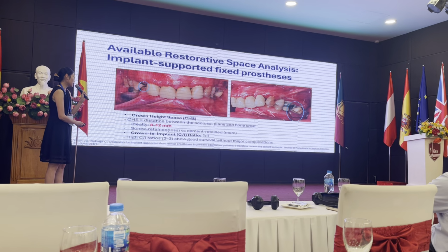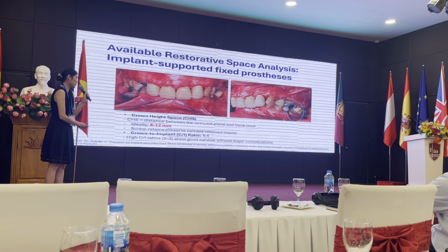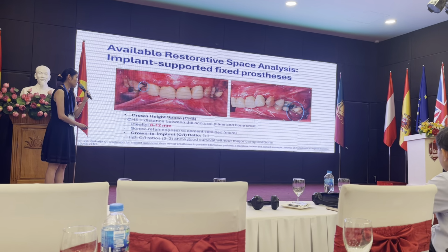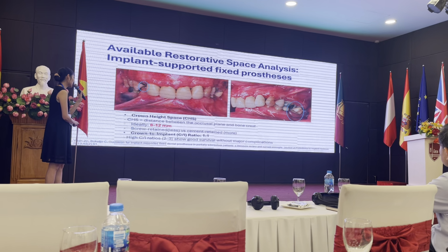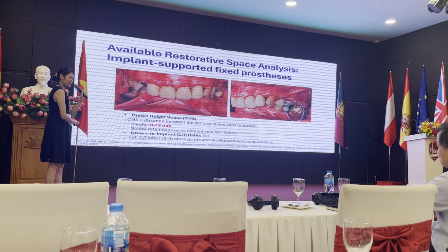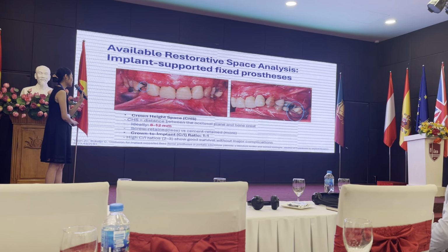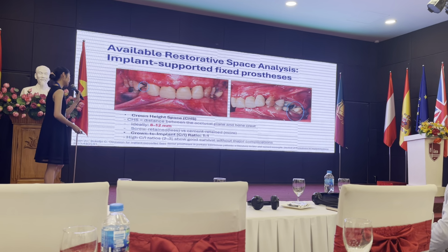You can think about if we place a dental implant here, the top molar is really super erupted, so we don't have a good space to do any protrusive or lateral movement. And also the patient wants to get a dental implant here, but you can see the space is quite limited. So if you place a dental implant here, the material might fracture, and that's the thing you want to foresee.